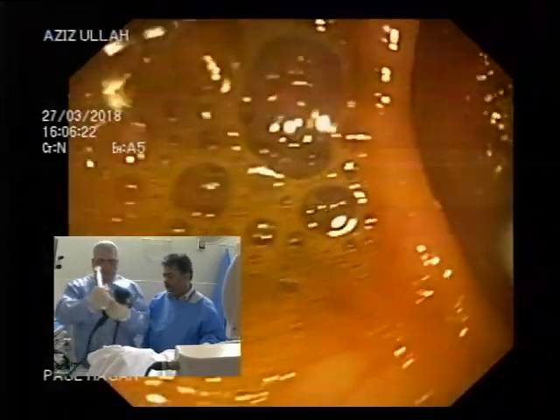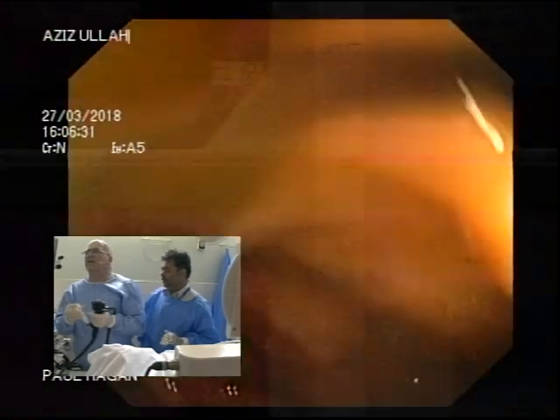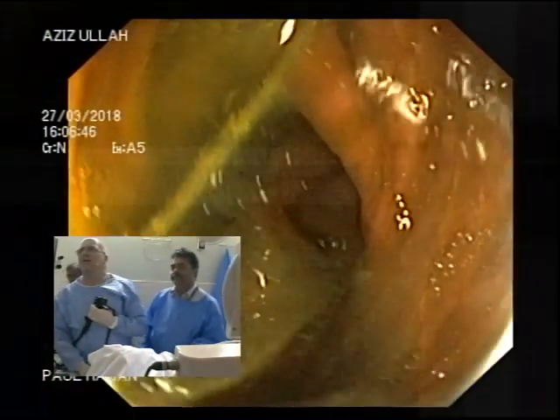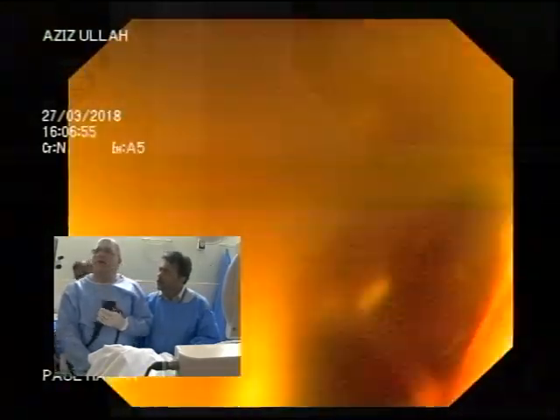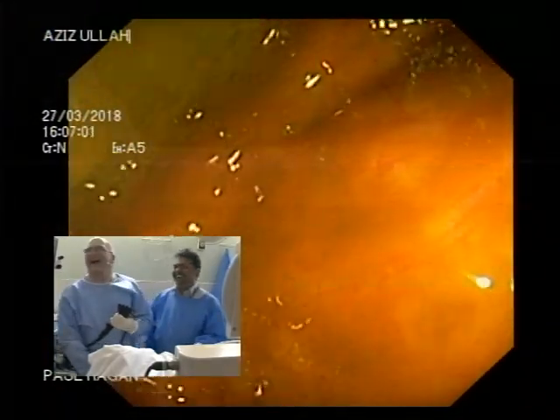As I've said before, don't put the syringe in this way, you trap your finger. Rotate the syringe and put it in this way. As I said about tennis players, I like to feel the syringe in the hand. You need more water? Not yet. Normally the guys don't like to see you doing that. Back at my hospital, as soon as they see I've got the syringe in my hand like that, they'll whip it out. Look, he's doing it.